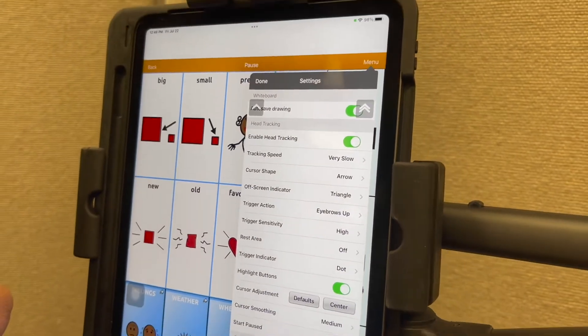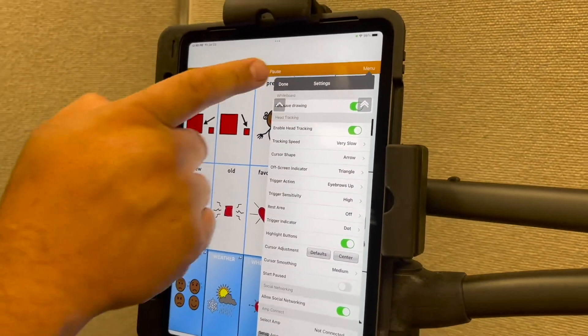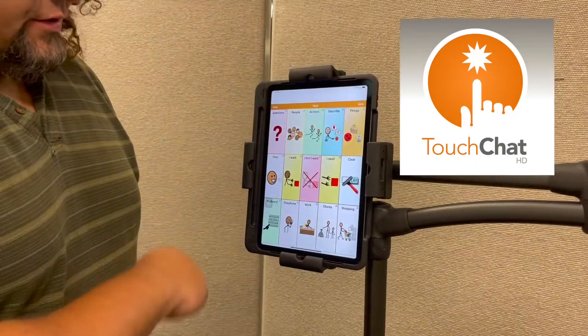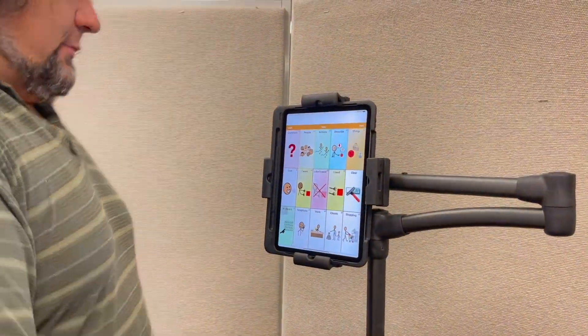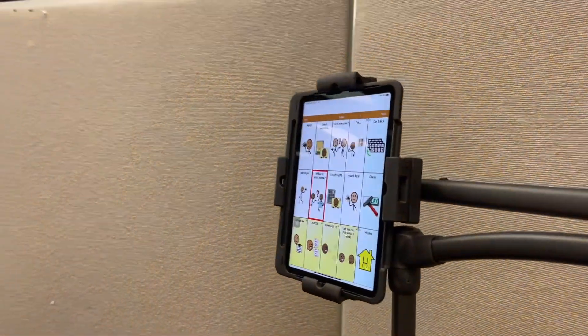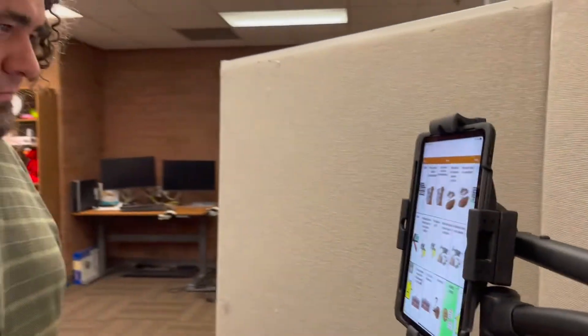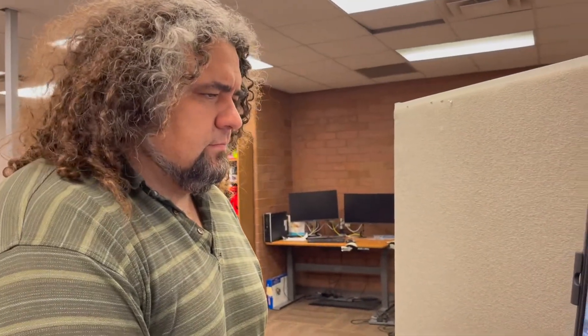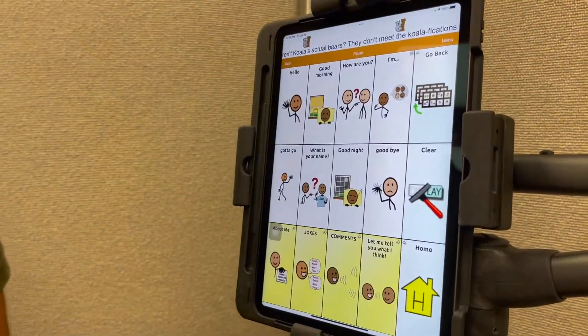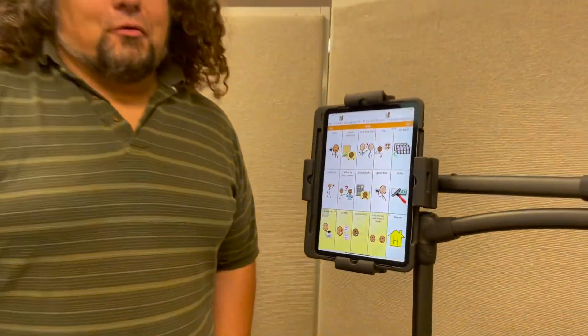So you can change based on what the person's needs would be. And just as a quick demonstration, we'll show a quick joke. So as you can see, another great option to be able to allow people to have more interaction with their community or their classroom.